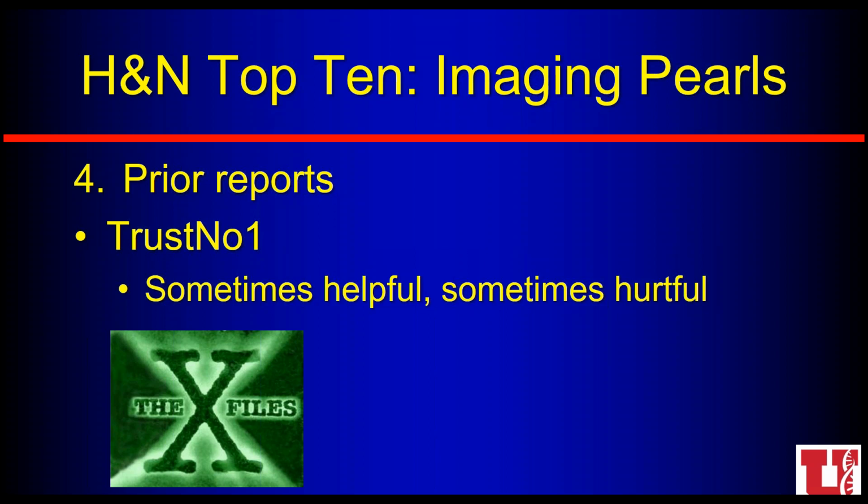I do go back and try to look at the prior studies and their reports, but I don't necessarily believe everything that they say in there. I want to be sure that what I'm looking at matches those prior reports. And I don't even believe myself from a study from 10 or 20 years ago if I have a prior report that I did on the prior study.